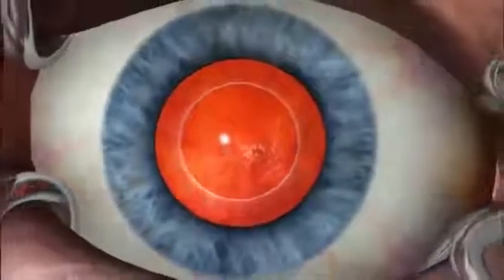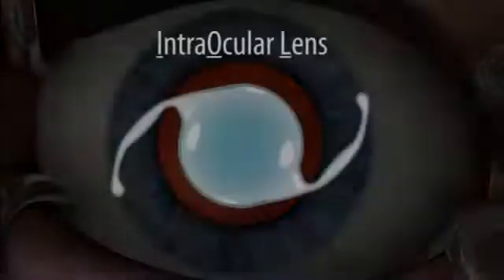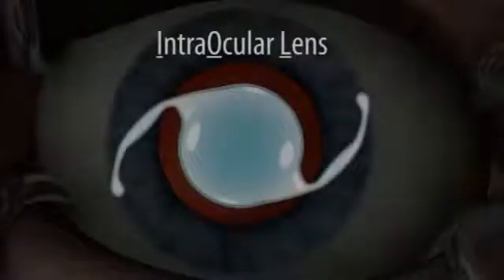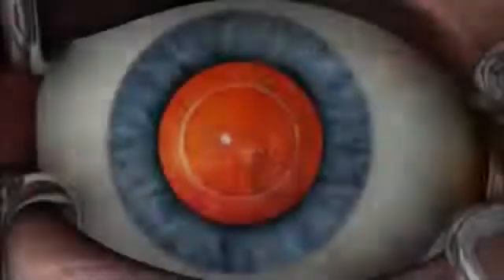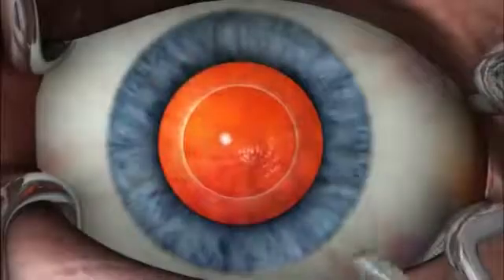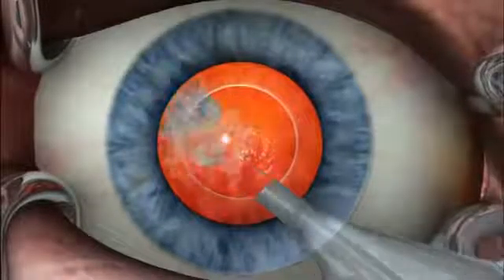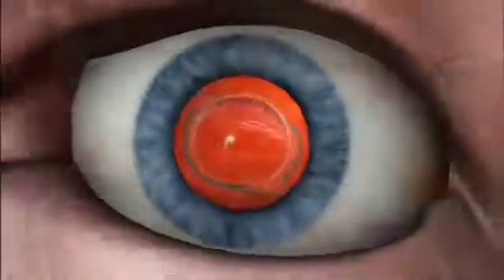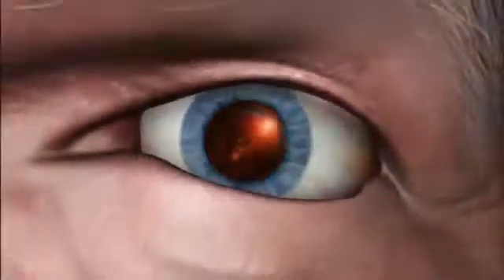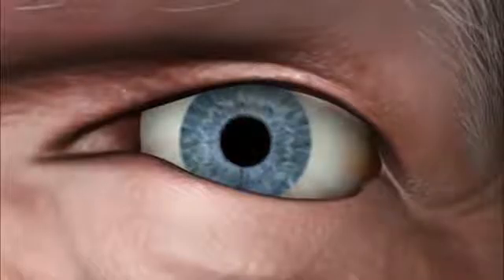Once the cataract is removed, an intraocular lens, or IOL, will be placed into the empty lens capsule. Small struts will hold it in place. Once properly positioned, the synthetic IOL restores the patient's vision.